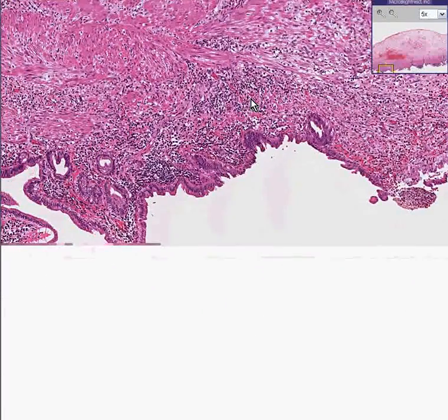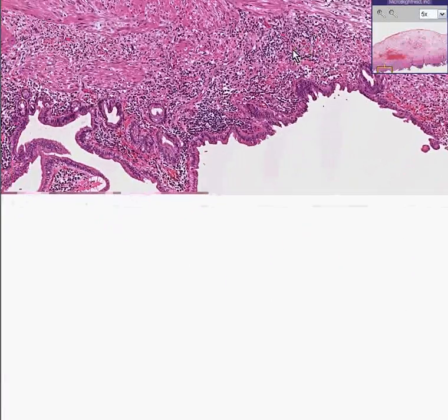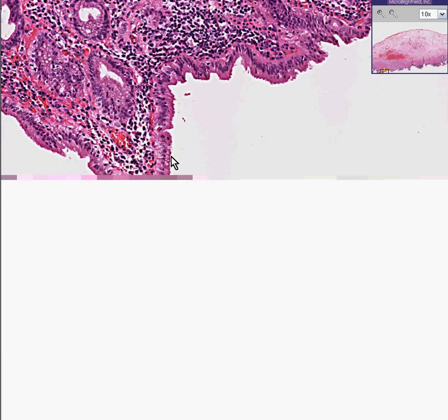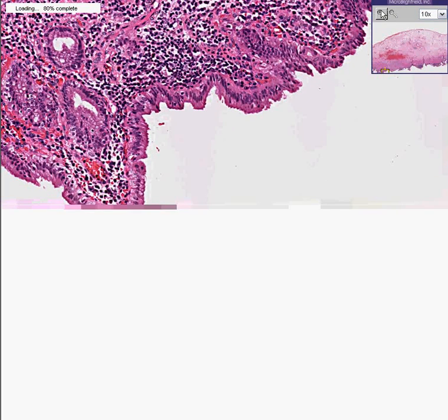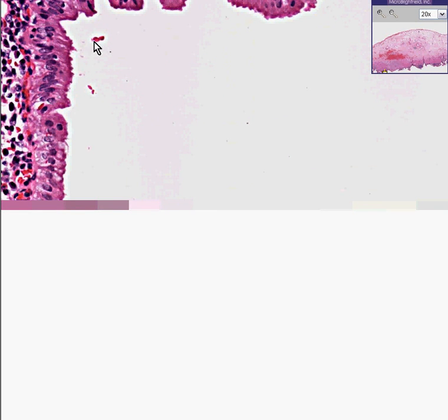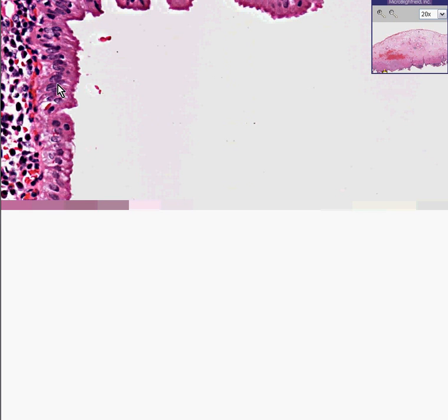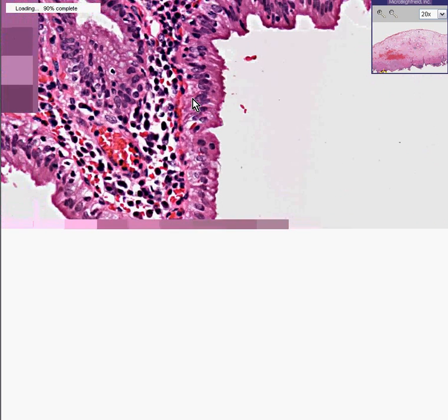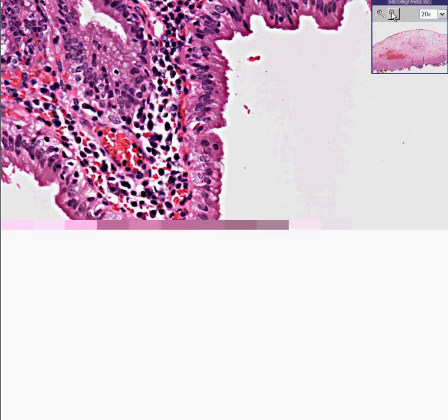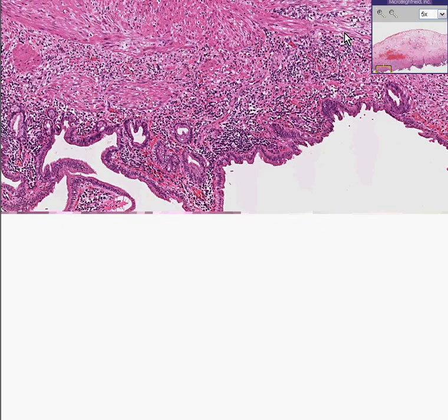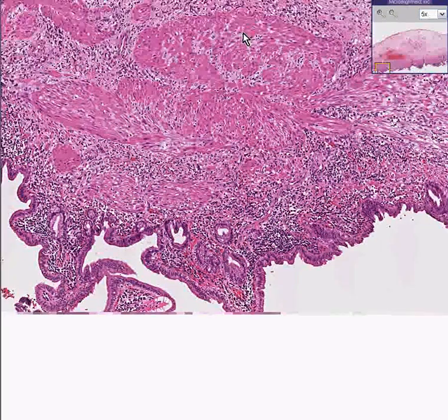Also notice we use the gallbladder in histology lab as the prime example of simple columnar epithelium because it lines up so nicely — nuclei at the base, a nice border on top. This is classical textbook columnar epithelium, but it happens to be overlying a mucosa and muscular layers that are chronically inflamed.